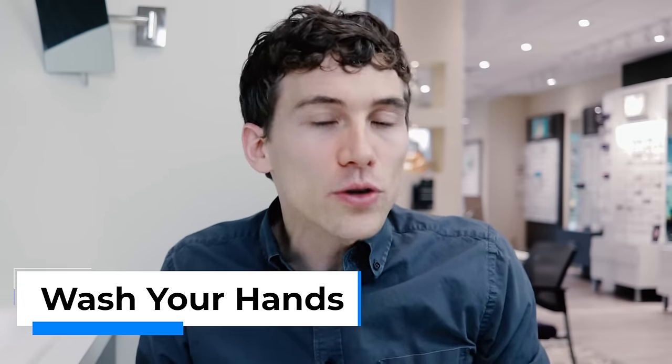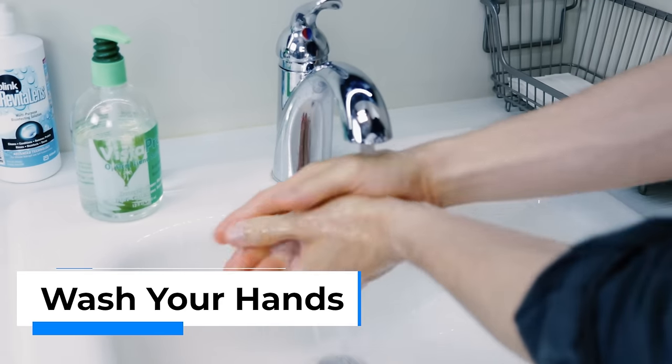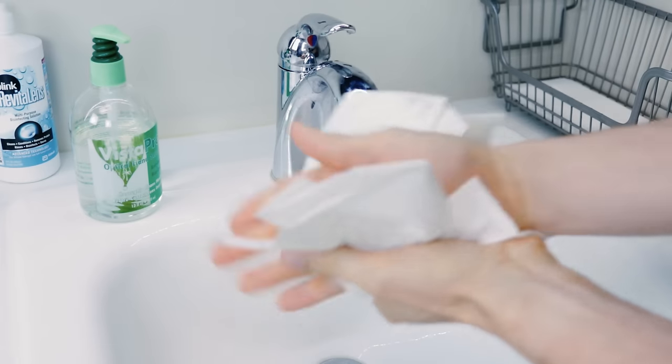Now, the first thing whenever you're going to touch or handle contact lenses — make sure you wash your hands. I know you're taking the lenses out, but still you want to wash your hands, get any sort of bacteria or debris off of your hands, because you are going to be touching the contact lenses on your eye. And if you miss once or twice, that could end up getting in the eye, and you just don't want that.